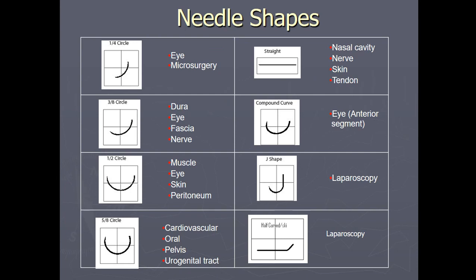Nowadays, for example in laparoscopic procedures, the J-shaped needle they have mentioned, conventionally we are not using that kind of J-shaped needle. Instead we are using a half circle needle, and the proximal portion, that is towards the thread, we straighten. In that way we can introduce a 30 mm needle through the port, a 10 mm port, and inside you can do endosuturing. Okay, thank you.